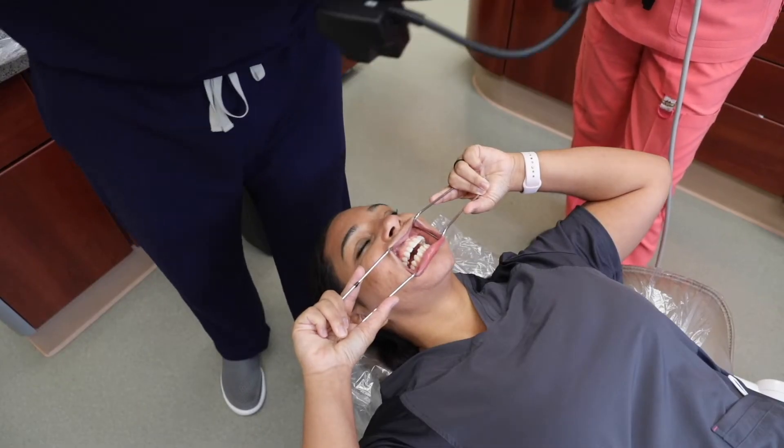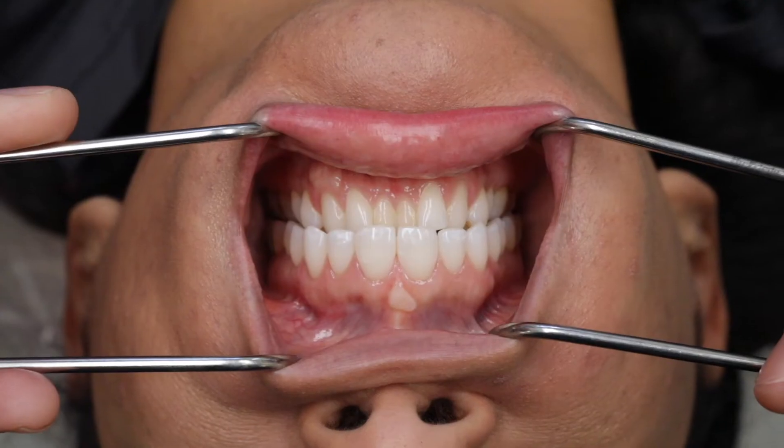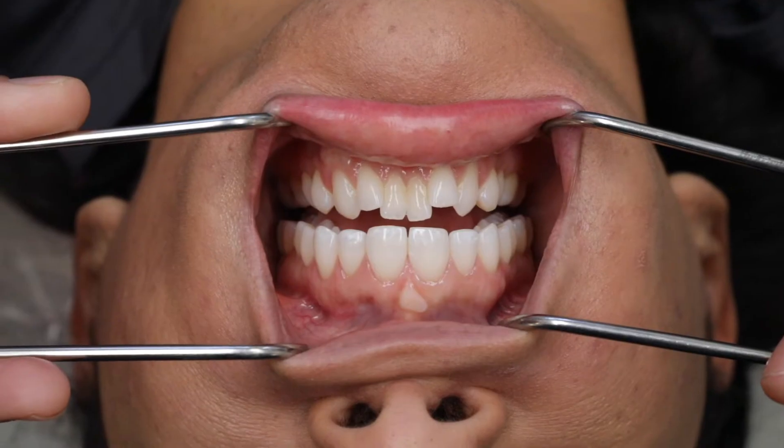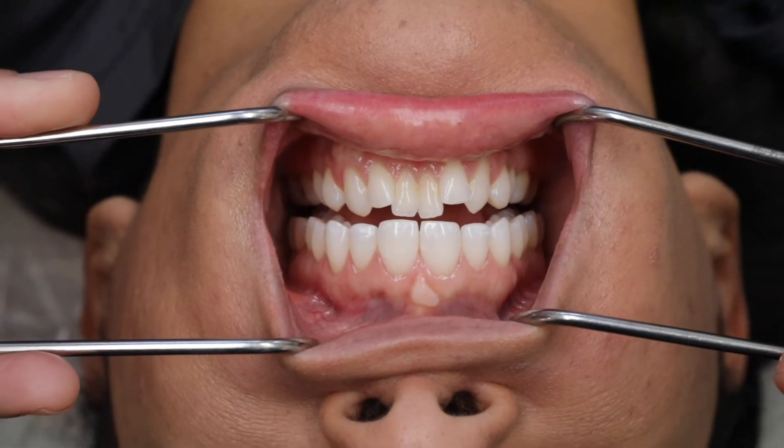The retracted teeth apart shot is framed exactly like the retracted teeth together image, except the patient is slightly open with the teeth apart so you can visualize the incisal edges of all the anterior teeth.